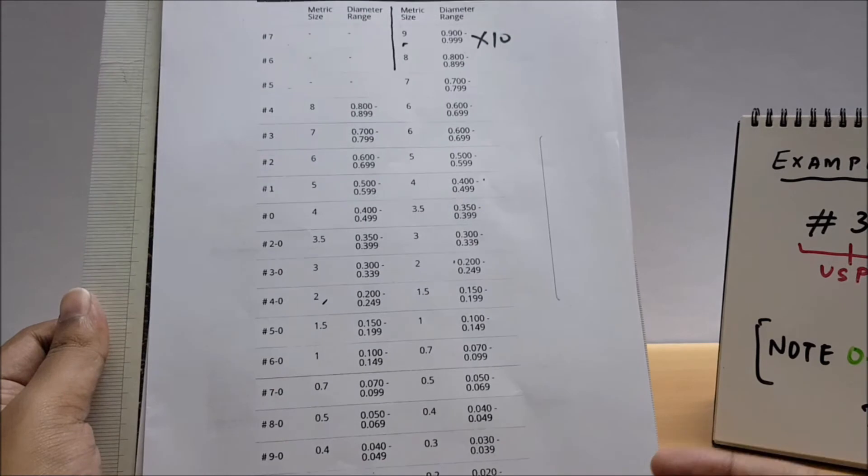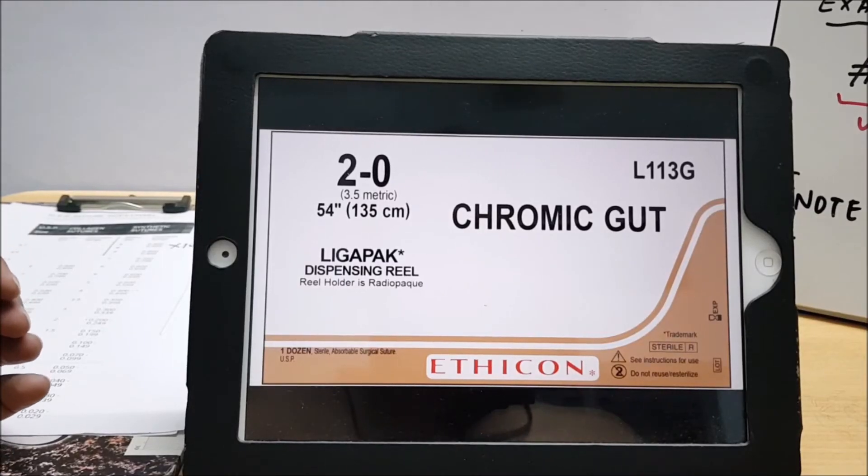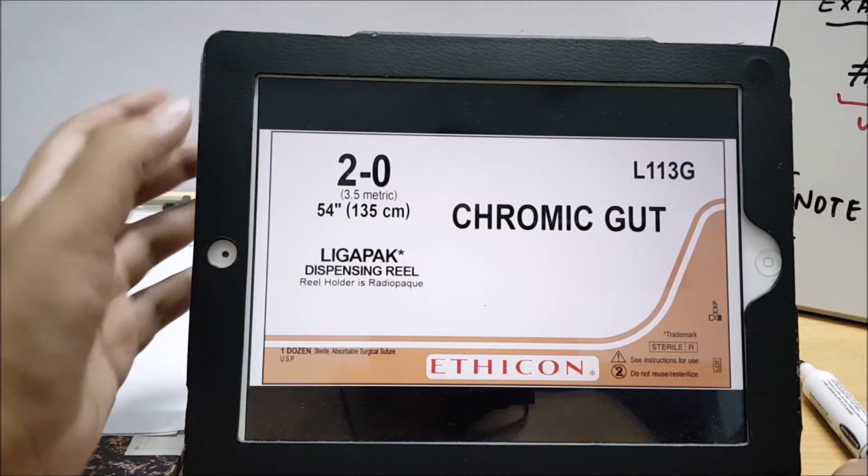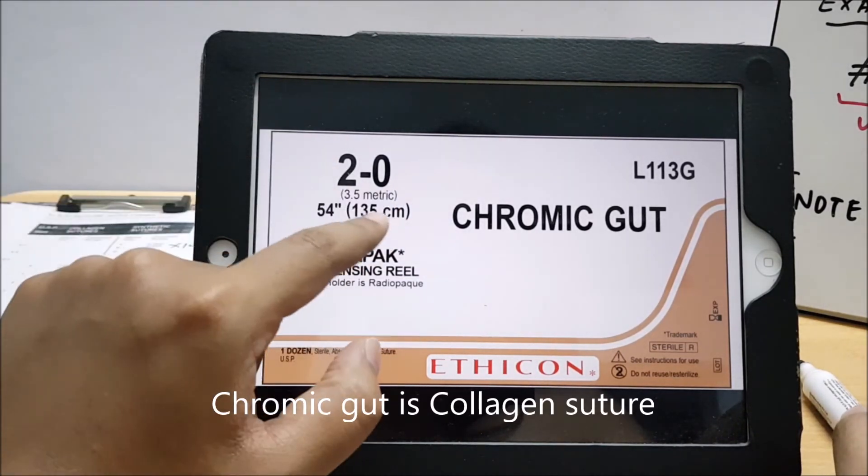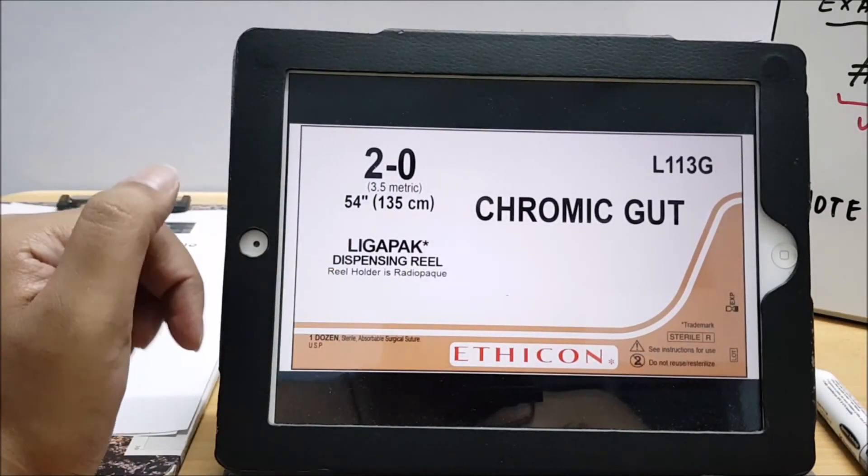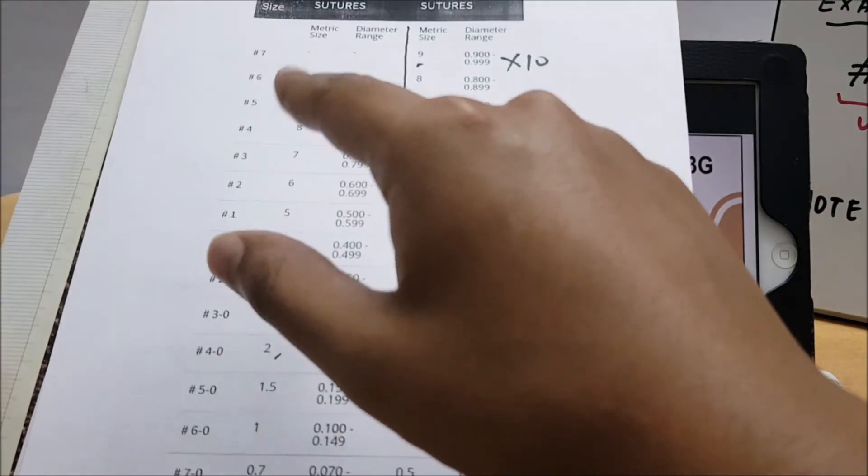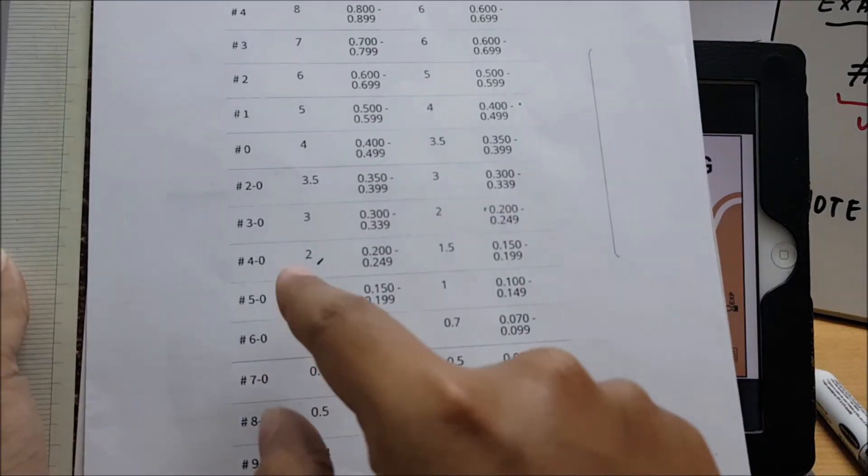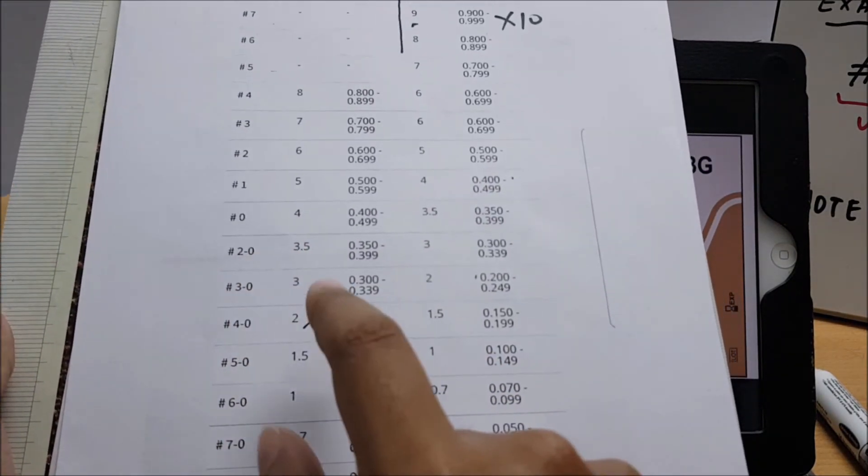So friends, here we have like 2-0 suture. As we already discussed, 2-0 means in metric it would be 3.5. Now chromic is a collagen suture. Now you may confuse - why 2-0, 3.5? Come back to this table, friends. This is collagen. So we are seeing at 2-0. Let us go to 2-0 - this is 2-0, and what is the metric size, friends? Yes, 3.5. So it is a collagen suture. This is also a way of identifying.